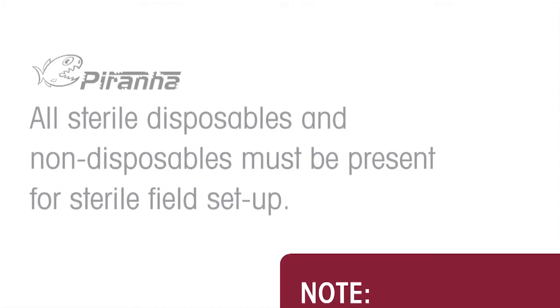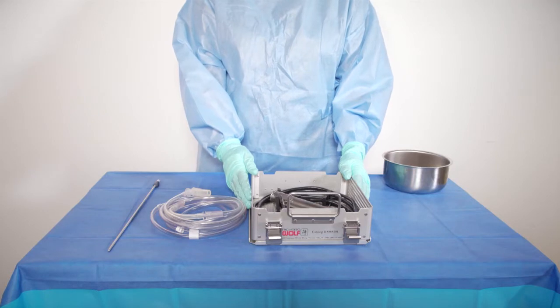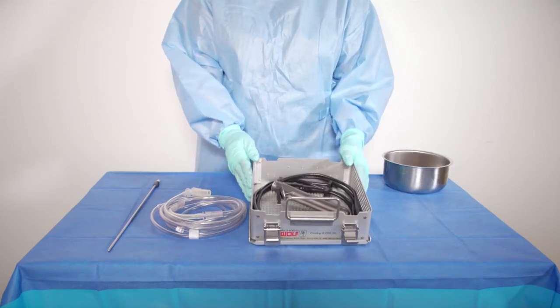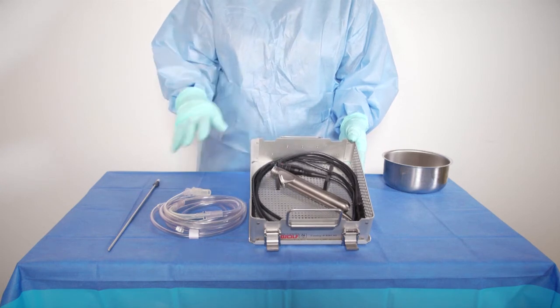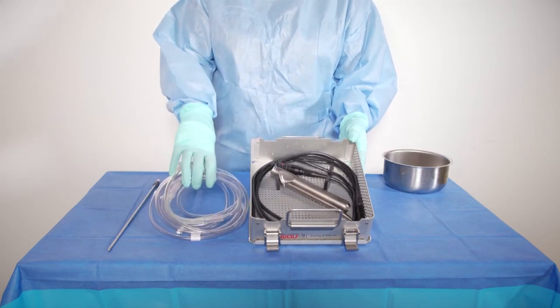Once the Piranha system is fully assembled, turned on, and ready for setup, the sterile team member will set up the power stick with cord, the suction tube set, and rotational morcellator blade.